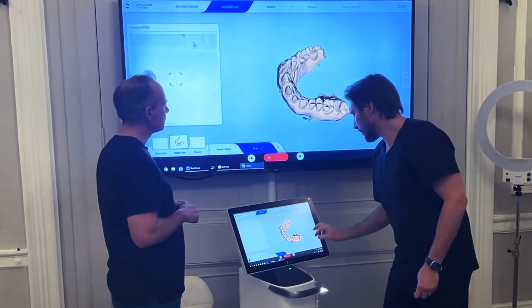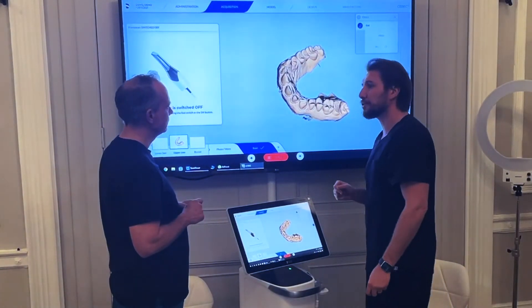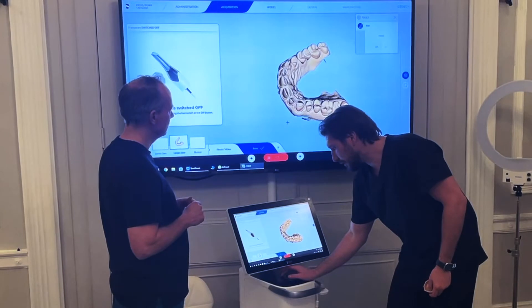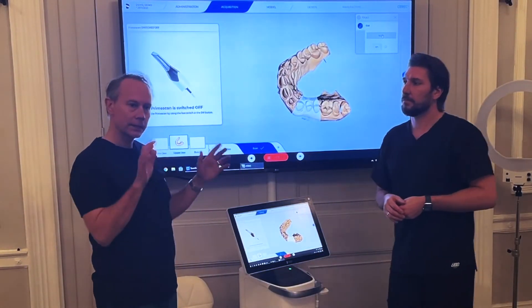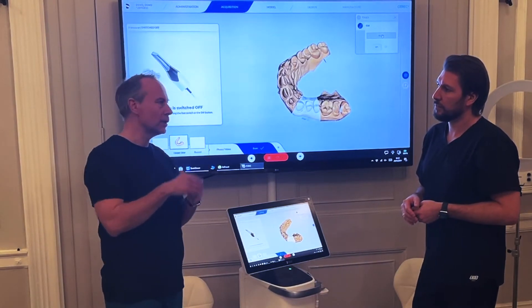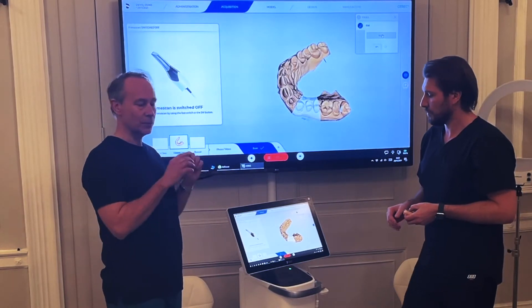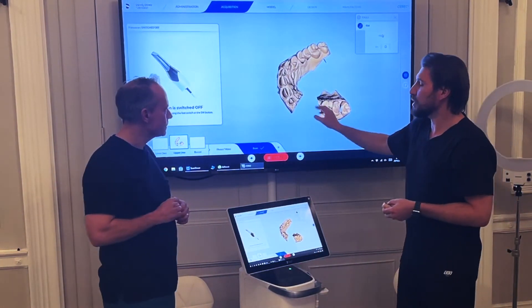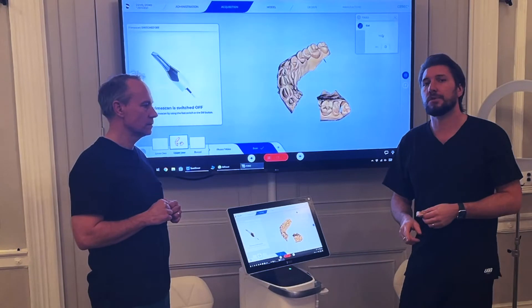If there's been a little bleeding you can chop that area out and re-scan it. Click the cut button — one thing that does frustrate me is that I can't use the touch screen for the cut; I have to use the touchpad. When you do single clicks it creates an arch shape. If you want a sharp corner, double-click and it won't bend the line, which is useful for going through a very tight contact.